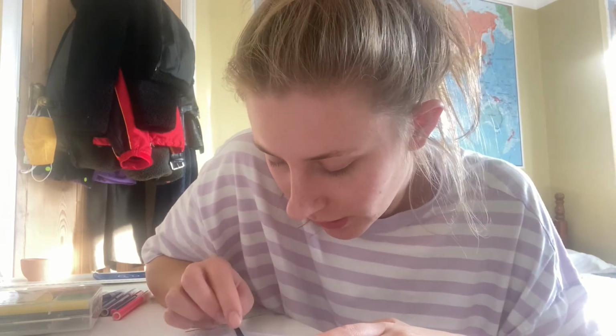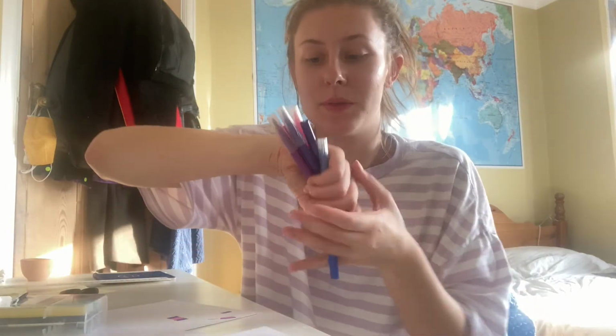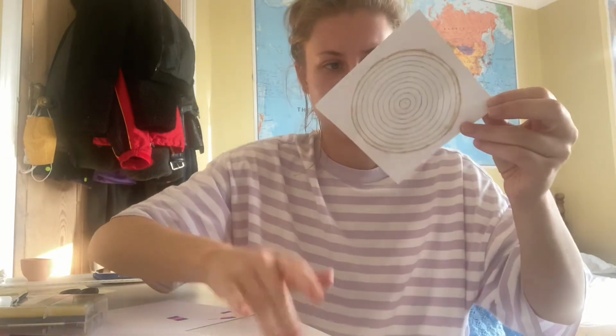So I'm just smoothing out some of the PVA so it's not too lumpy, and then I'm going to let that dry again, and then I'll come back and colour it. And as you can see, got these pens out. I'm going to go for a purple and pink theme, like a little gradient effect, I think. So yeah, hopefully that will look cute, and I'll come back when the PVA is all dry and we can colour it. That might be today, it might be tomorrow. I'm going to see how long it takes to dry.